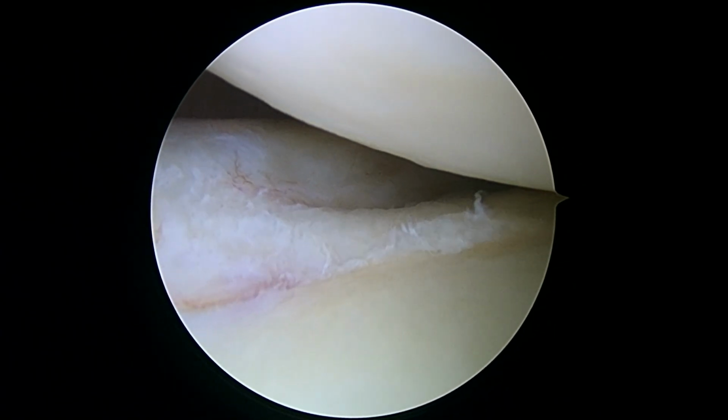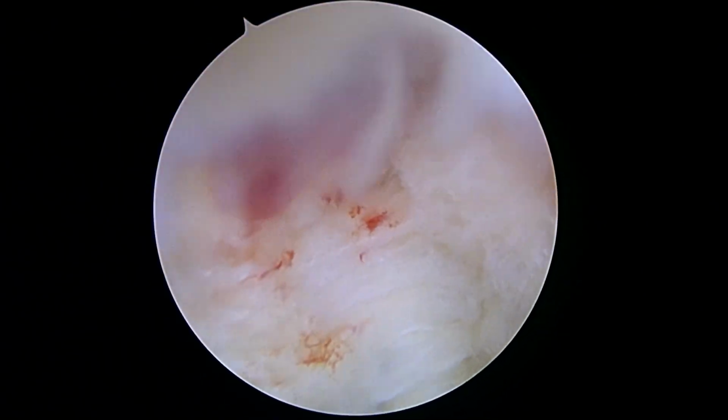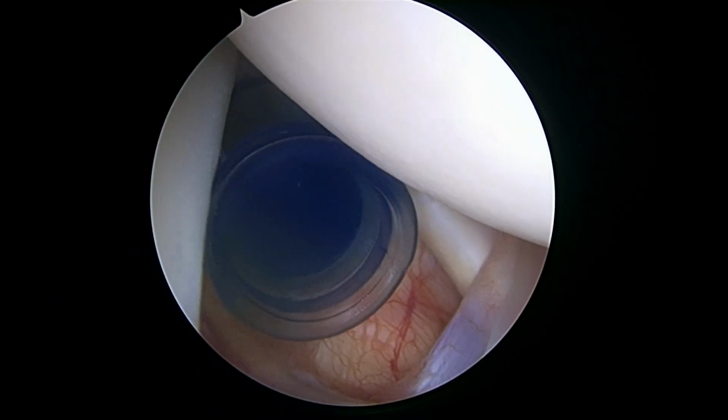Okay, so I think inside the joint we've seen everything we need to see. We've done the first step in the repair, which is in the space from the undersurface. Now we're going to switch positions with your shoulder.